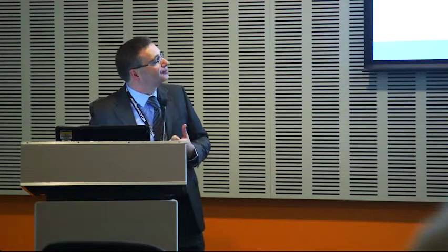So it's a matching and marrying process. That's a very simple statement, but the art of scleral contact lens fitting is truly that. And we need more knowledge about the shape of the eye to give us the flexibility and the understanding of how to best fit our patients and achieve that.